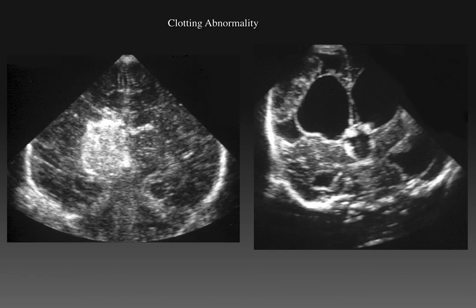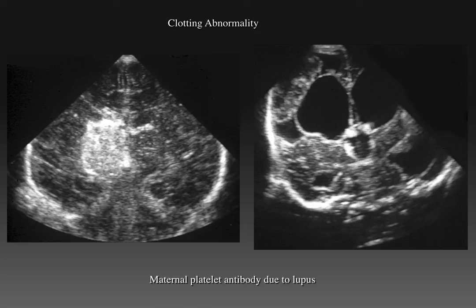However, hemorrhages in term and near-term infants are often different in location, cause, and appearance. Here are two near-term infants with a clotting abnormality. The infant on the left has a brightly echogenic thalamic hemorrhage. The infant on the right has post-hemorrhagic hydrocephalus and a moderately echogenic clot in the parietal region. Both infants were infants of mothers who had lupus and had platelet antibodies.